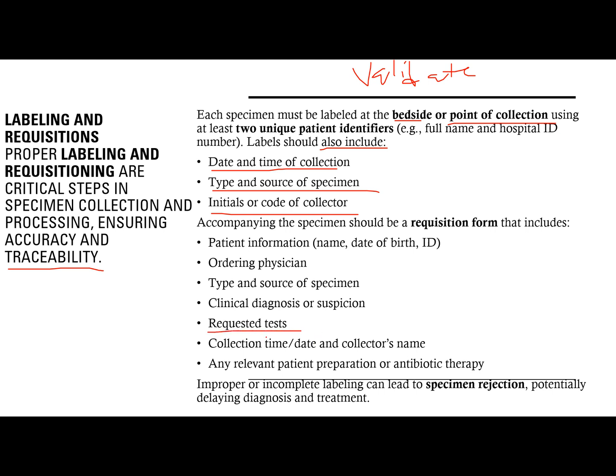So as medtech, class, dun pa lang i-check nyo na kung ano yung test na nire-request. If the doctor is asking for prothrombin time, tapos ang kinolek mong container is EDTA or yung violet top, patay ka. It's already rejected. So you need to make sure that you collect the proper container for the sample. Then take note of the collection time and date and collector's name. So anong oras mo kinolek, ilalagay mo yun sa request form. Ilalagay mo rin yung pangalan mo. Kahit yung initials mo, class, kahit yung last name, then initial ng first name.